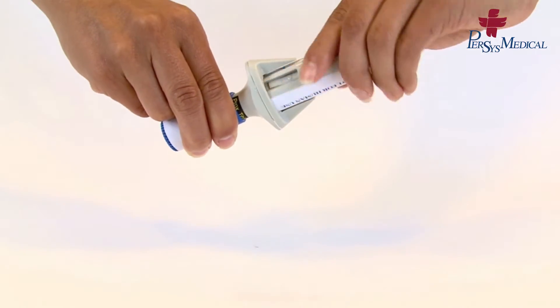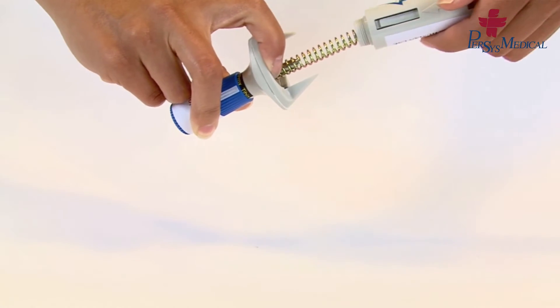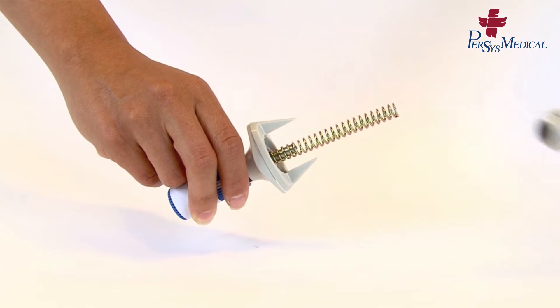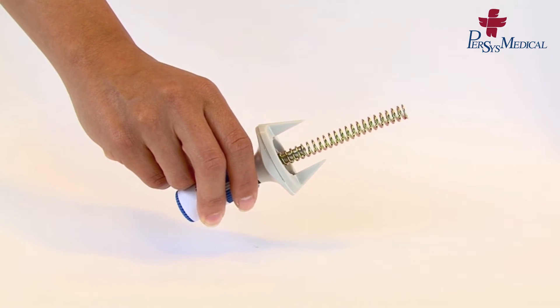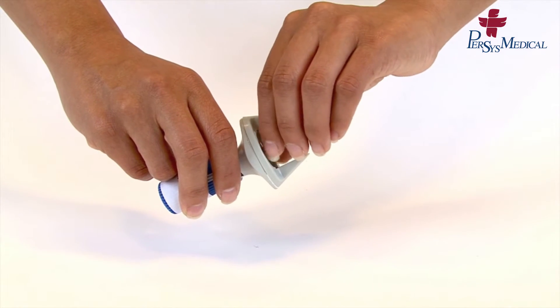Unscrew the bottom barrel from the top barrel. Take out the spring, then remove the piston.